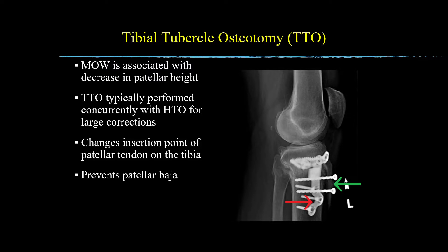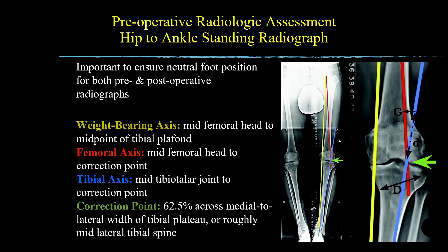This lateral radiograph depicts a medial opening wedge HTO with plate and screw fixation, as shown by the red arrow, in conjunction with the TTO secured by two screws, as shown by the green arrow.